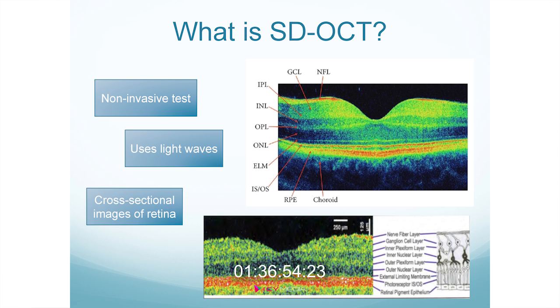So as a final tribute, this is the slide that has carried us through every presentation. You have to understand the anatomy of the OCT scan to understand how to interpret it. We know that OCT is a non-invasive test. It takes seconds to obtain behind a machine like a photo. It uses light waves, again, to obtain a tomographic or cross-sectional image of the retina.